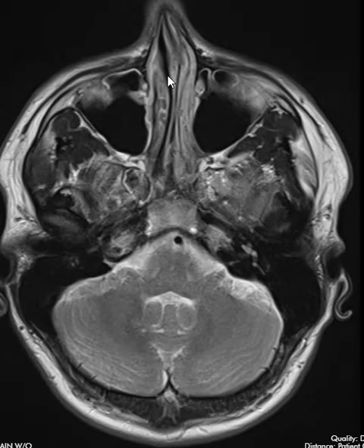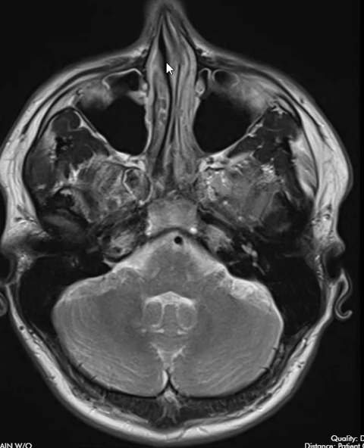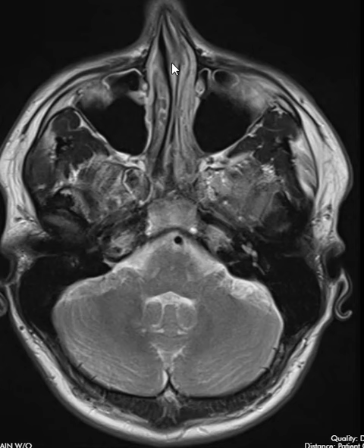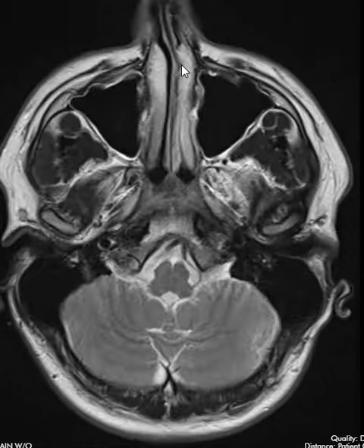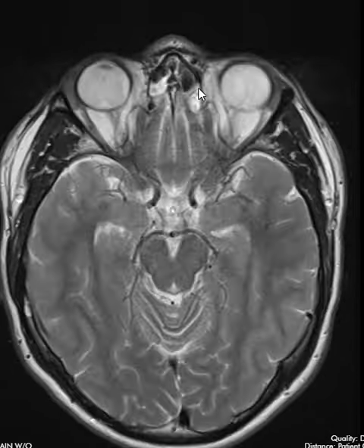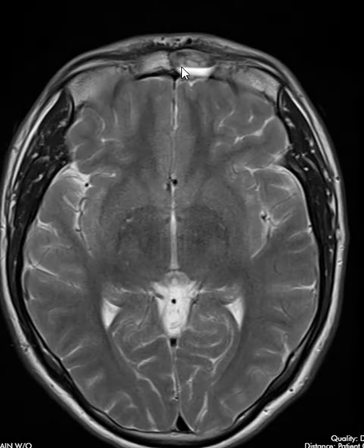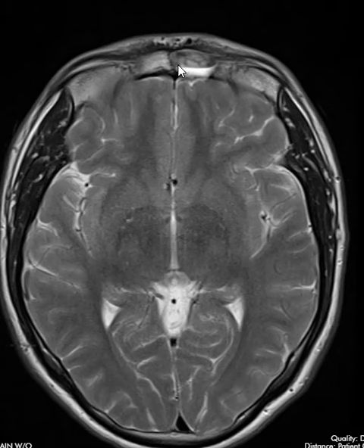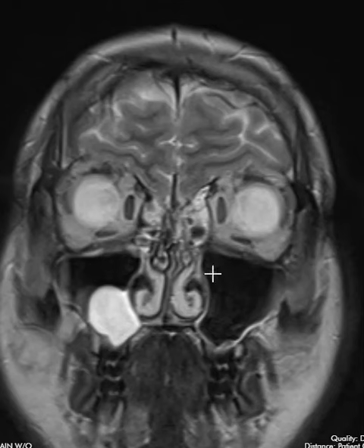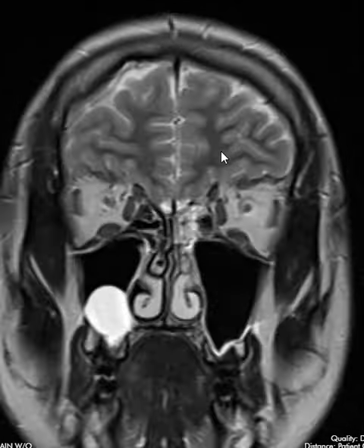You can also see here this nasal septum. We should have a very straight band in the middle. This nasal septum is deviated towards the left, so they have nasal septal deviation. They also had a little bit of fluid and mucosal thickening up top here — this is the left frontal sinus. So they did have some sinus disease that would explain their headaches and pressure.